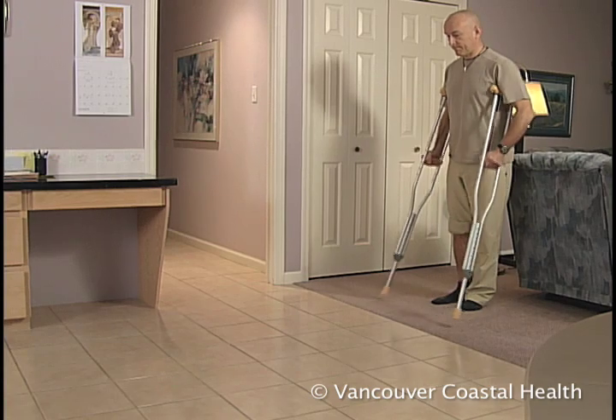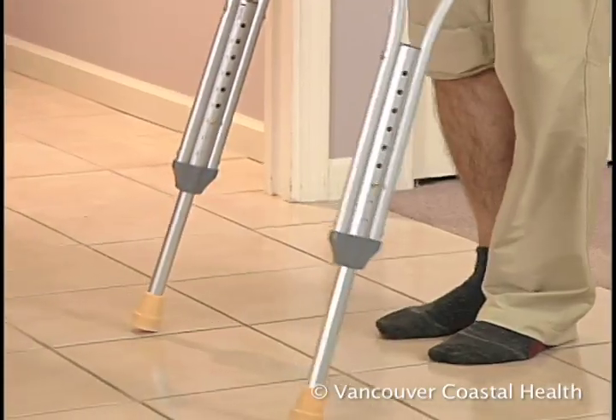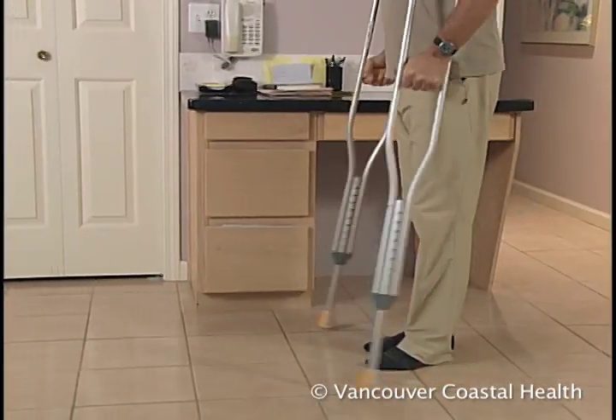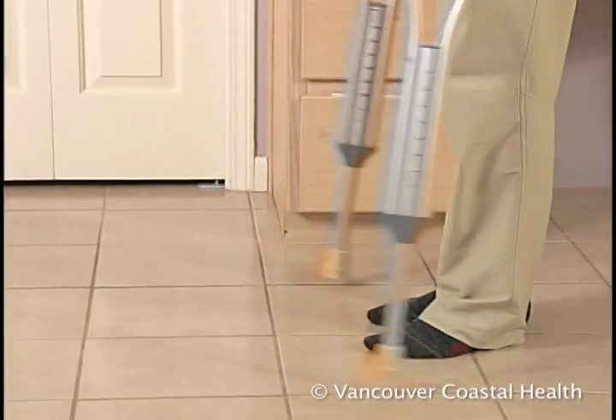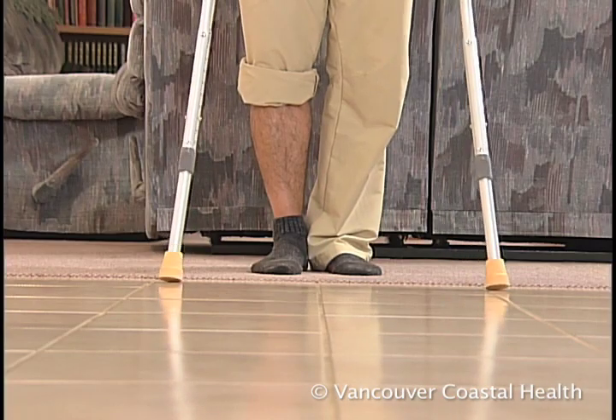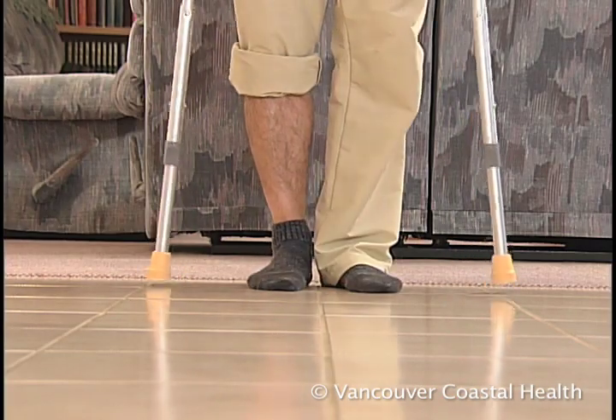Start walking by placing the crutches in front of you. Then, step with your surgical leg. Press down through your arms and follow with your strong or non-surgical leg. So, crutches, surgical leg, then strong leg.